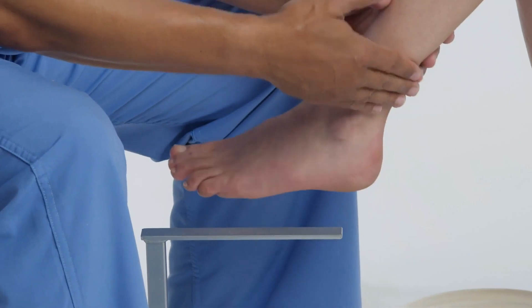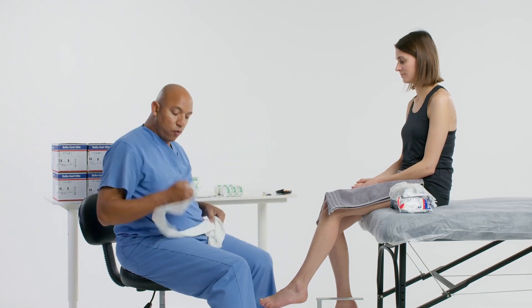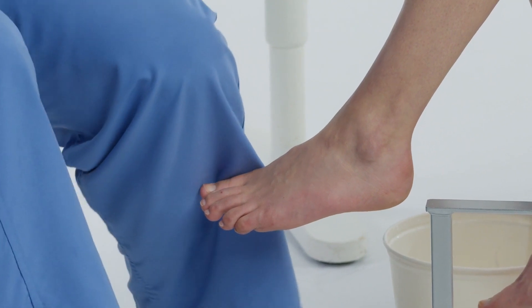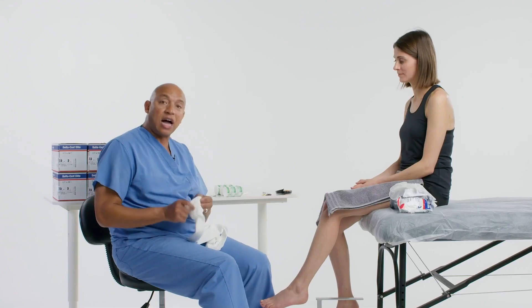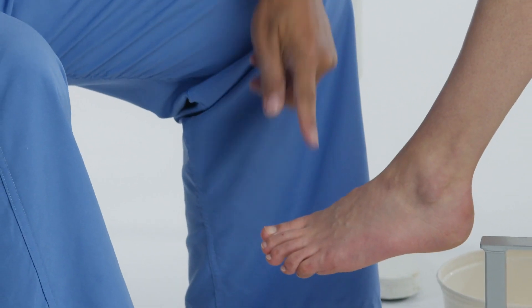The patient is in a lot of pain, so let's show how we would do it. Go ahead and lift your leg up. Let's put some stockinette on first. There are two different ways to apply the stockinette with the footstand. If the patient is in a lot of pain, you might have to put your hand through the stockinette, grab their foot, and slide the stockinette up the extremity. We are going to stop the cast at the web on the dorsal side, just below the web space of the toes. On the plantar aspect, we're going to stop it at the ball of the foot and have a sunrise look around the foot, leaving the fifth toe open so that they can articulate their toe.